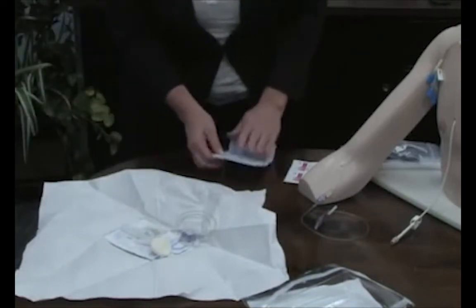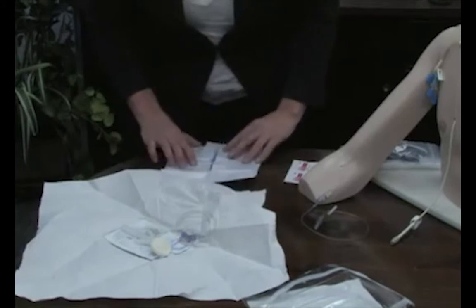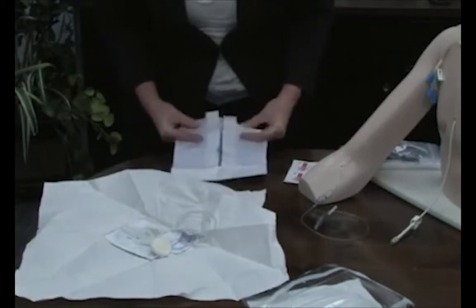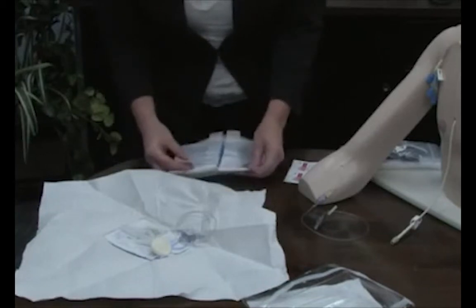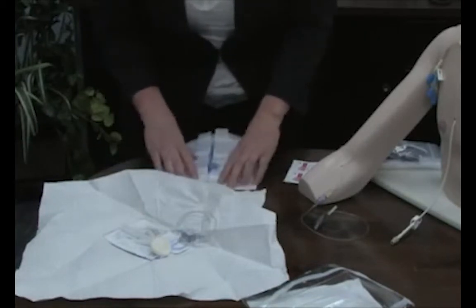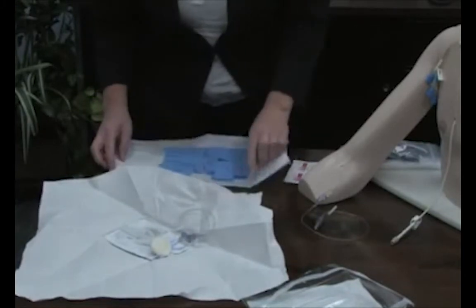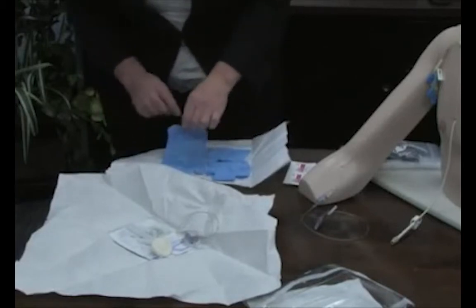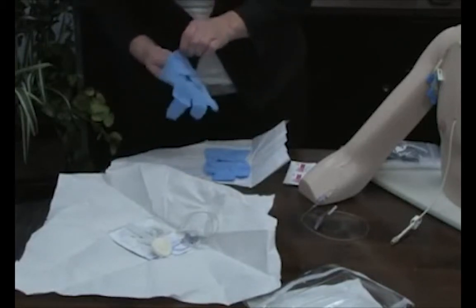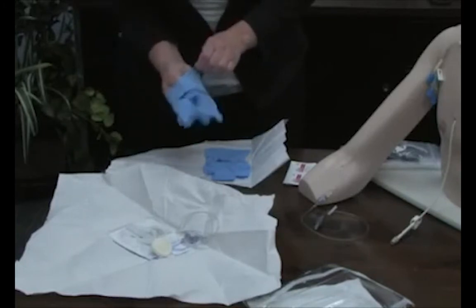Now for my sterile gloves, I usually carry sterile gloves with me in case the ones in the kits are a little large. But as home care nurses, we're all used to making do with what we have, but we certainly pride ourselves on trying to give you supplies that work.